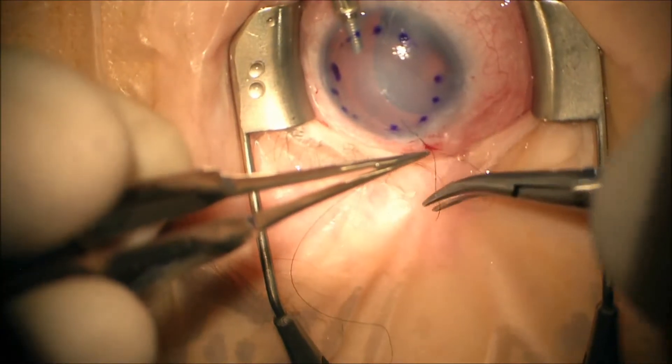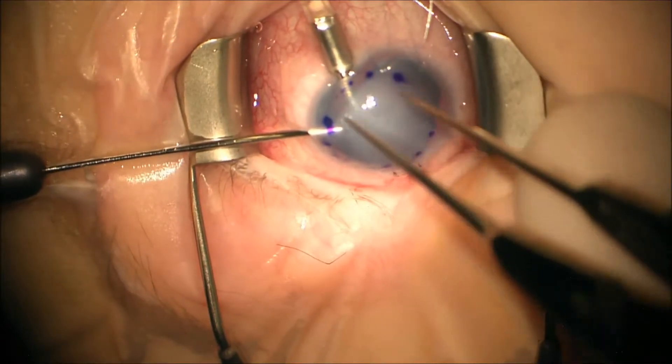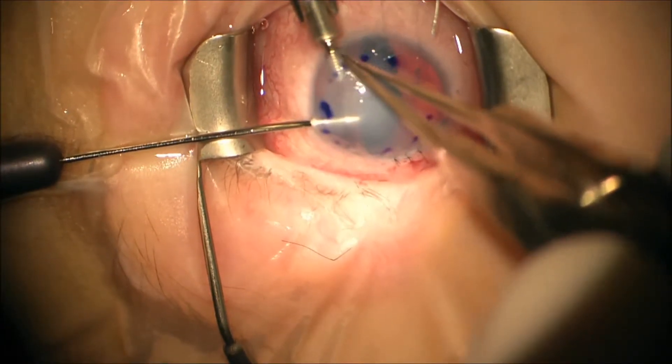Next we suture the main wound closed. Then we use a reverse Sinsky hook to essentially pull the graft over and then we remove the anterior chamber maintainer.